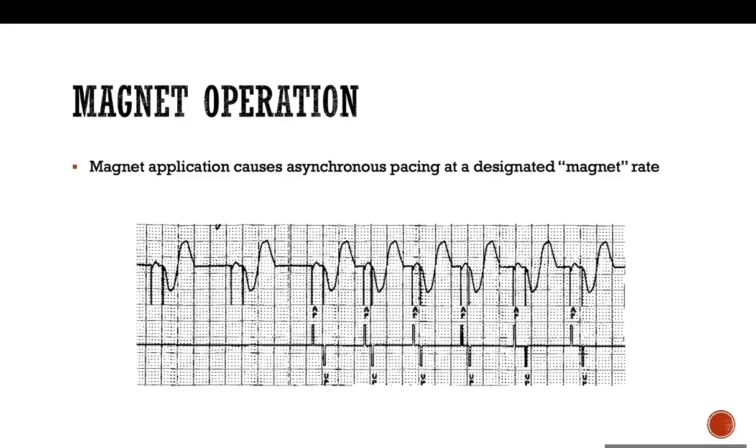So I wouldn't say that in someone in VT storm, you need to disable the shock. I'm saying someone in VT storm, you need to manage the patient and avoid excessive shocks, but that doesn't mean that if the shock is the only thing that's going to treat the patient, you disable it. I wouldn't disable a shock. I would try to maybe delay it, see if there's anything else. Any shock in someone who's in incessant VT or VF is actually more of a life-threatening emergency.